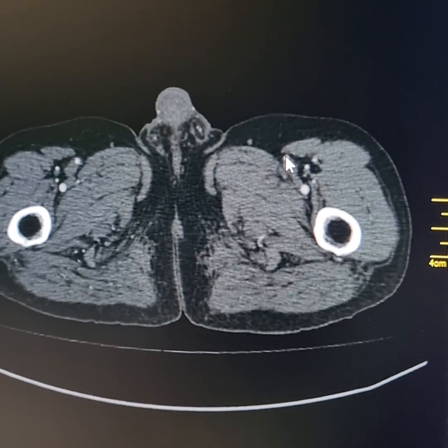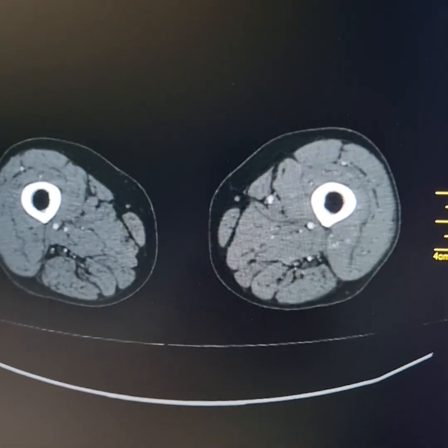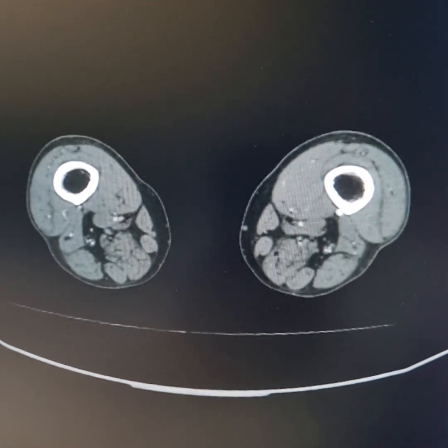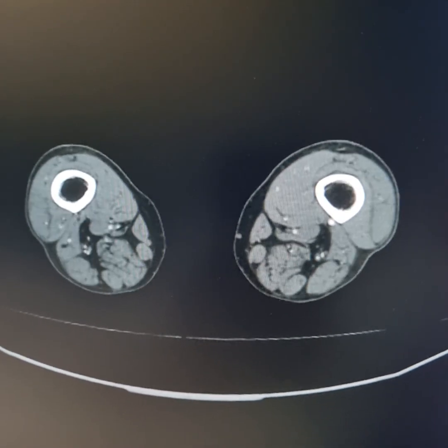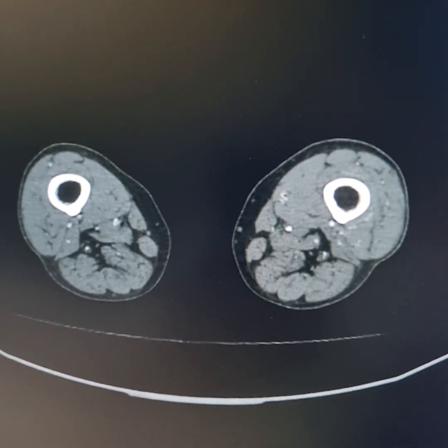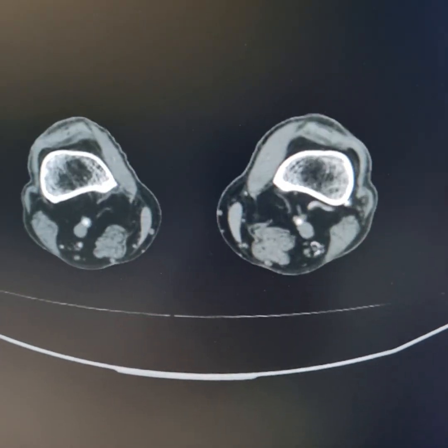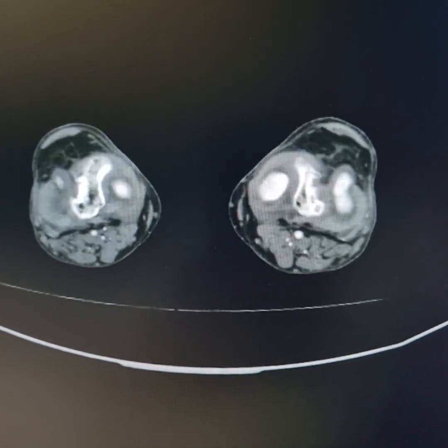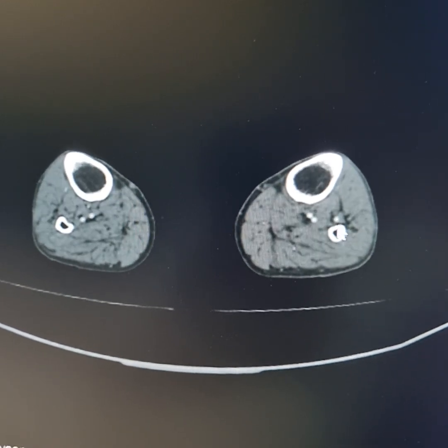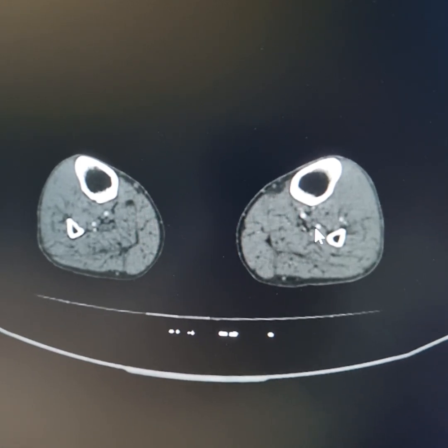This again is the superficial femoral artery. Its lumen is significantly narrowed as compared to the profunda femoris artery. Superficial femoral artery in the adductor canal. At places, for example at this level, its lumen is almost completely obliterated. But low down again, it is being reperfused from the collaterals. Popliteal artery. Now, this is the anterior tibial artery. It is patent. Posterior tibial artery, peroneal artery.